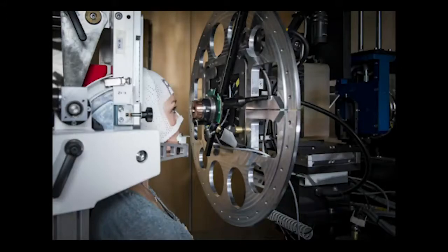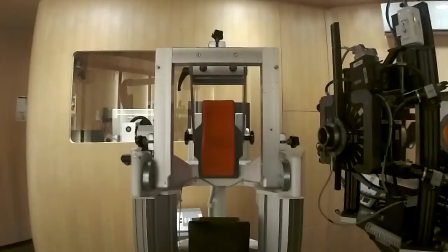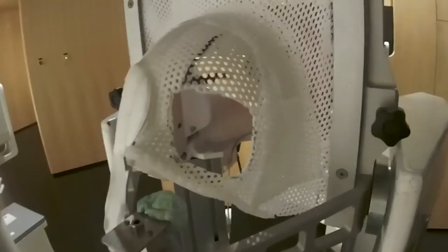Intraocular tumors have been treated in the last 30 years using proton therapy with outstanding clinical results. A proton beam, delivered through a fixed horizontal beamline, is targeted to the patient lesion to damage the DNA of the tumor cells and block their proliferation. During ocular proton therapy, the patient is seated on a robotic chair and immobilized using a thermoplastic mask and a bite block.